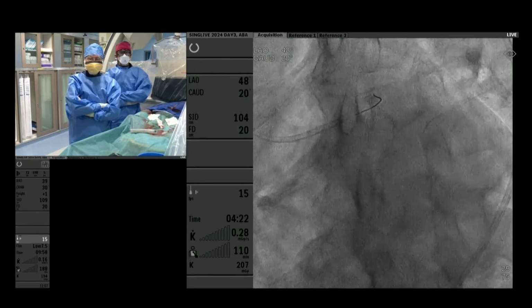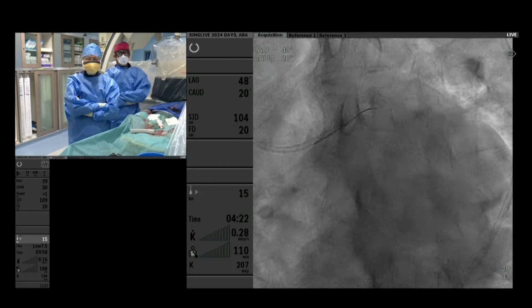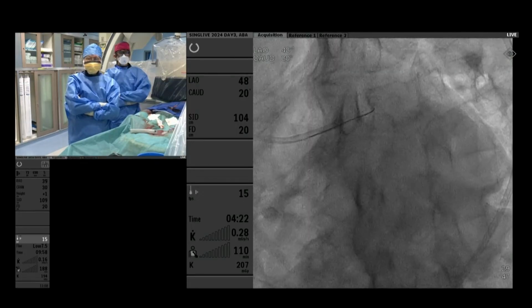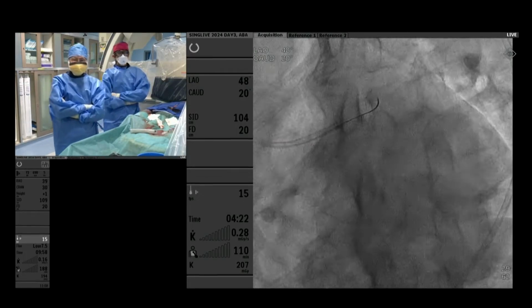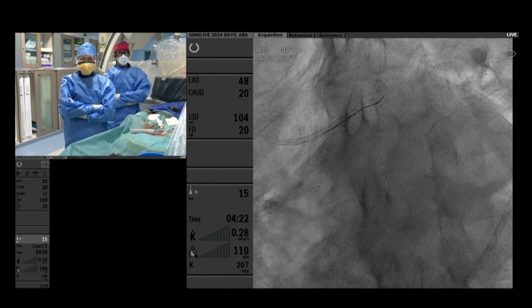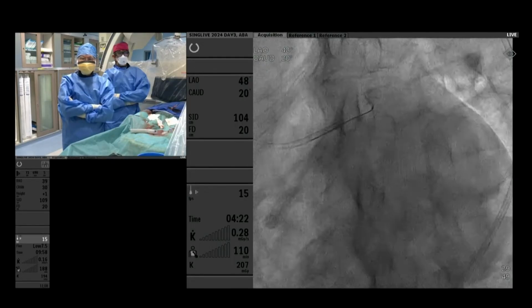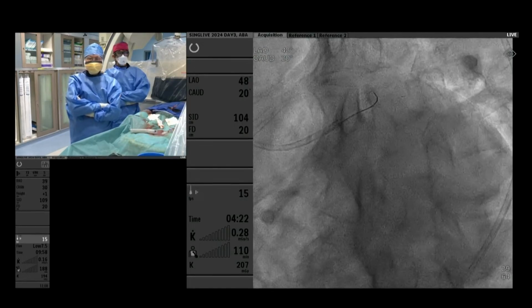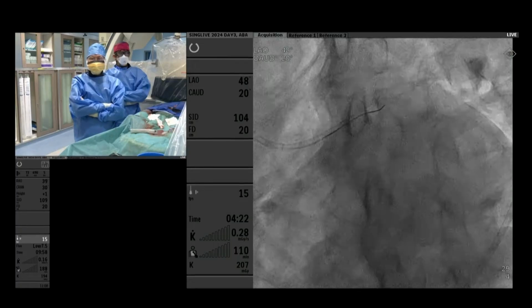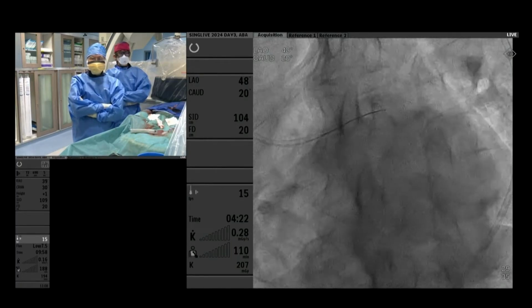I mean, in particular the hydration protocol for this patient. For us in Hong Kong, for these kinds of CKD patients, of course, we hydrate them, but on the day of procedure, before the first engagement, we usually try to further assess the filling pressure by means of an LVEDP.